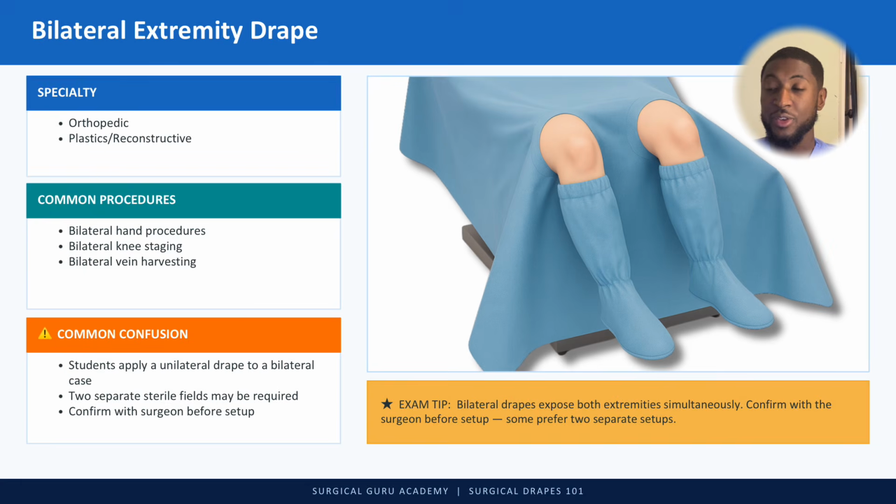Two separate sterile fields may be required depending on exactly what you're doing, or the doctor. Confirm with the surgeon before setup if you are doing a bilateral drape, or if they would like a bilateral drape. Bilateral drapes expose both extremities simultaneously. Confirm with the surgeon before setup. Some prefer two separate setups.